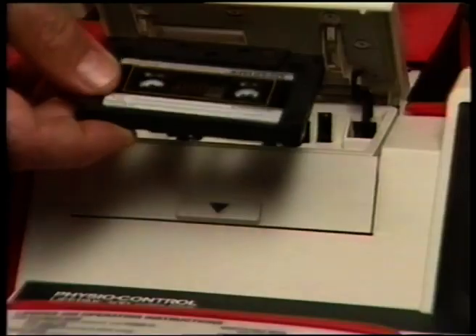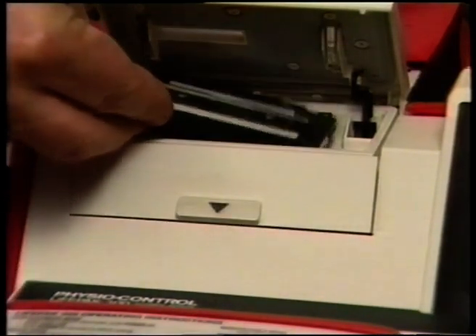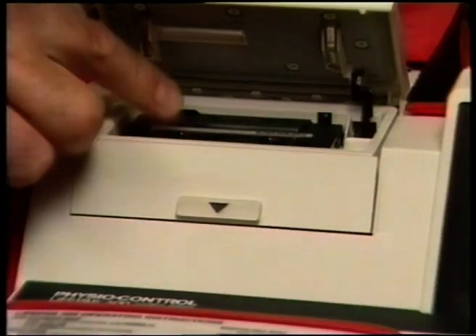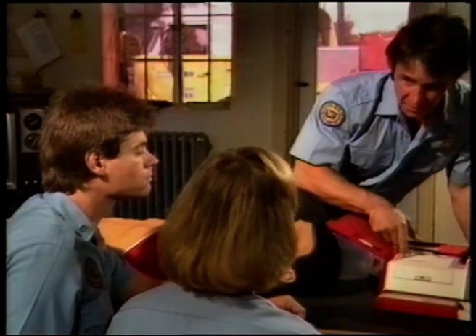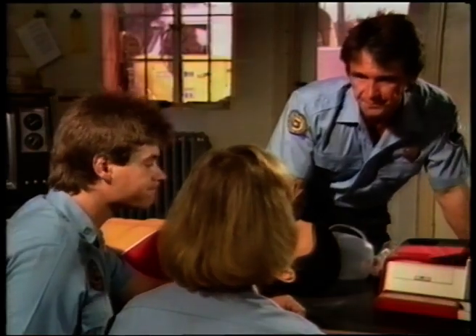To install, place the cassette so that the exposed tape faces to the back of the device and the full reel is on the right. Make sure that the tape is fully seated onto the tape drive before closing the tape door. A tape symbol located on the top of the door reminds you of the correct orientation of the tape.